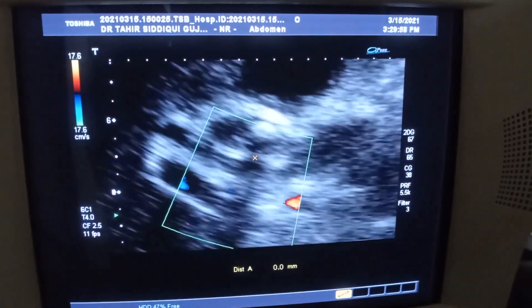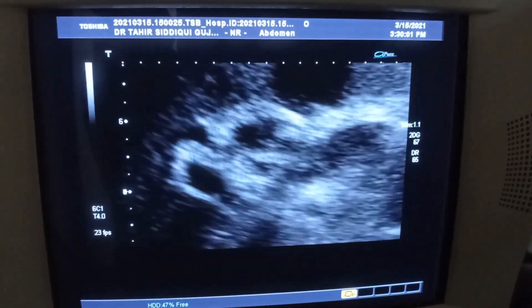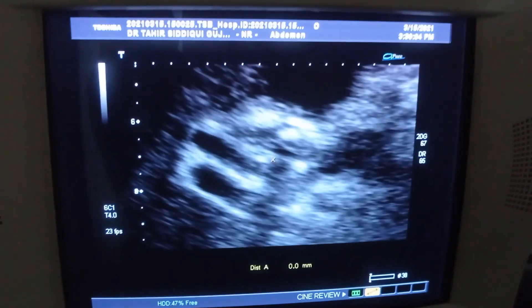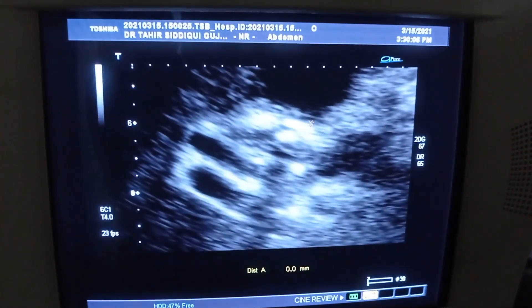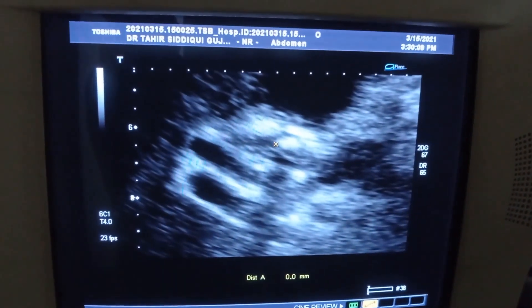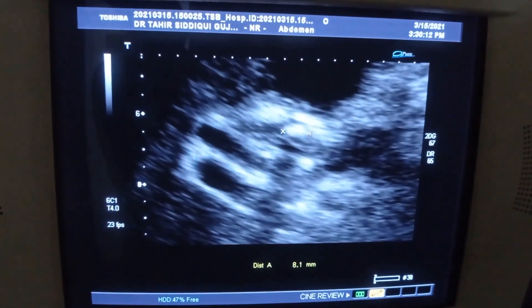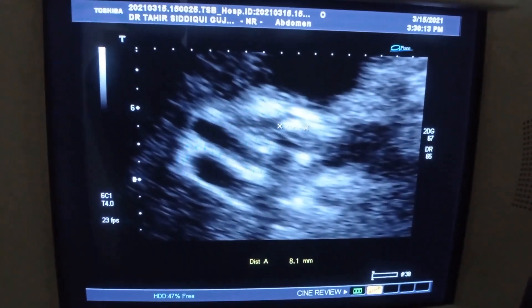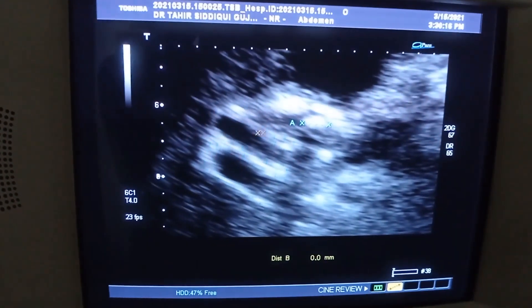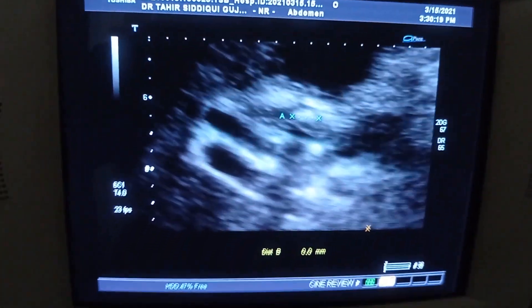Now there is a calculus impacted in the neck region of the gallbladder. Here it is — this is the gallbladder, this is the neck region, and this is a stone measuring approximately 8.8 millimeters. This is the common bile duct and this is the portal vein.